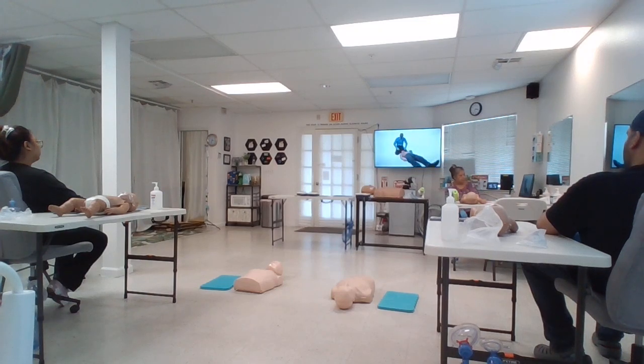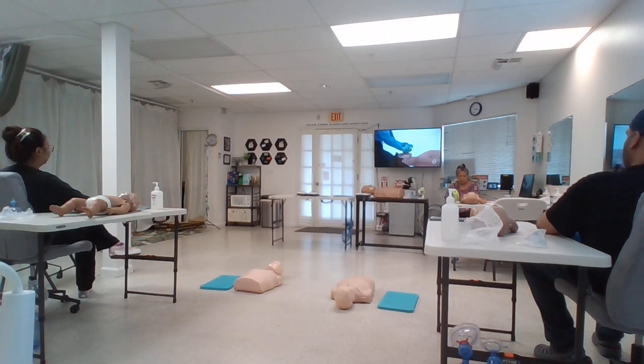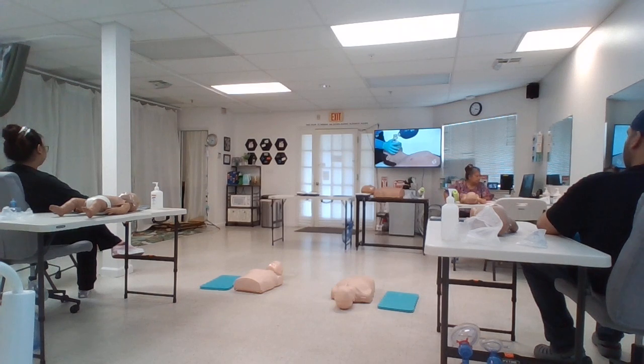To begin, position yourself directly above the person's head. You'll use the EC clamp technique to hold the mask in place. To do this, apply the mask by first placing the cushion at the narrow end of the mask onto the bridge of the person's nose. Then lower the mask fully onto the face, watching for the cushion to bulge as it initially seals against the face. Form a C with the thumb and index finger of one hand and press down on the dome of the mask toward the face to further seal the rim of the mask.